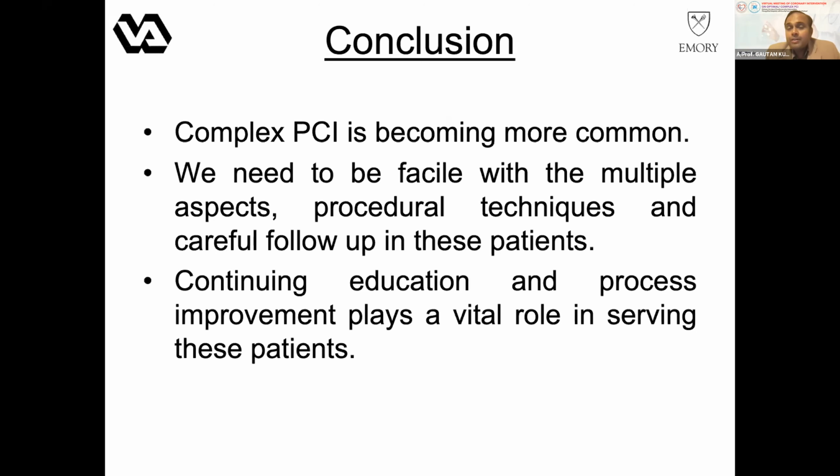That's a great question. It's actually a very complex answer as well. In the United States, and this may be the same in most of your labs as well, we may not have a choice of every different brand of stent that there is on the shelf. It may be what the hospital has the contract with that is available for you to use. So you have to be facile with the equipment that you do have.